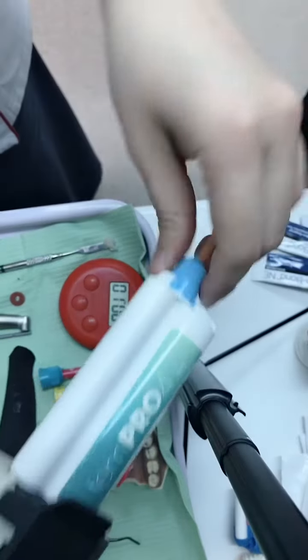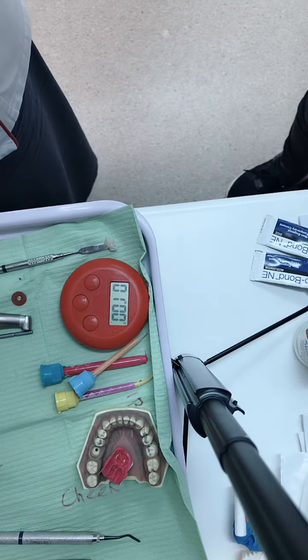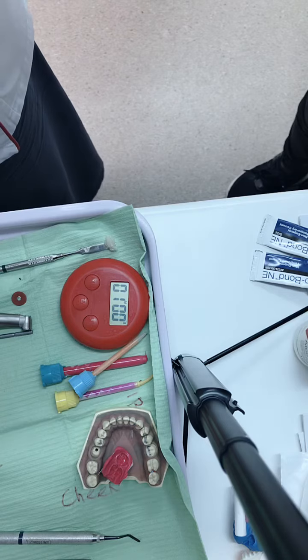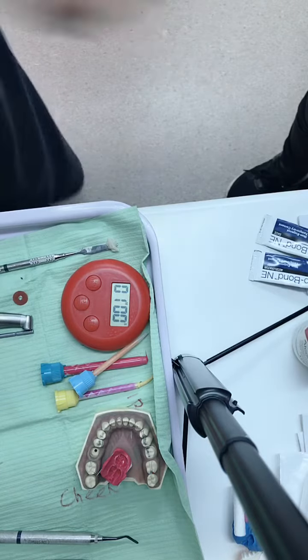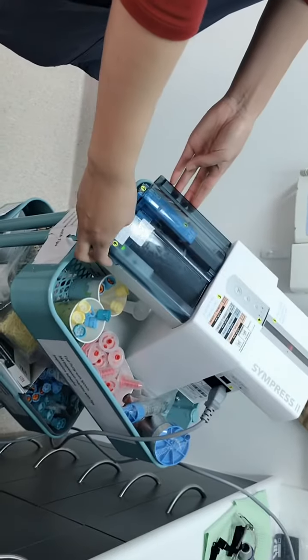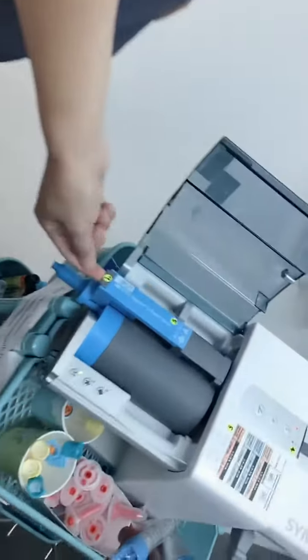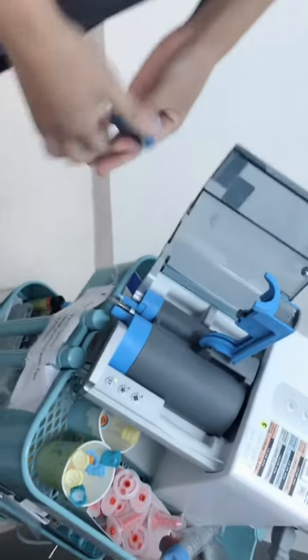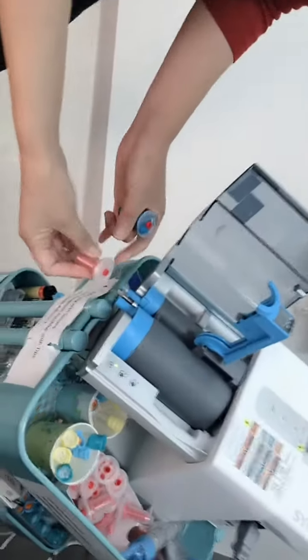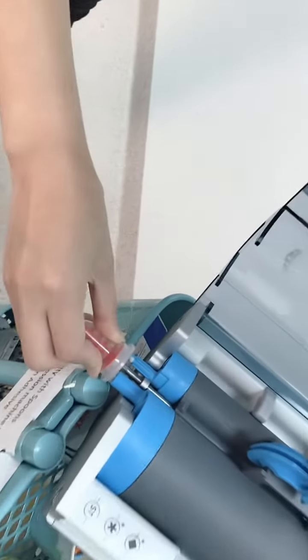And the very last is the temporary — change this as well. So that's pretty much done. The next thing we're going to do is to change the mixing tip for the heavy body. We will lift it, pull it out, and change it to a new one, then shut everything.